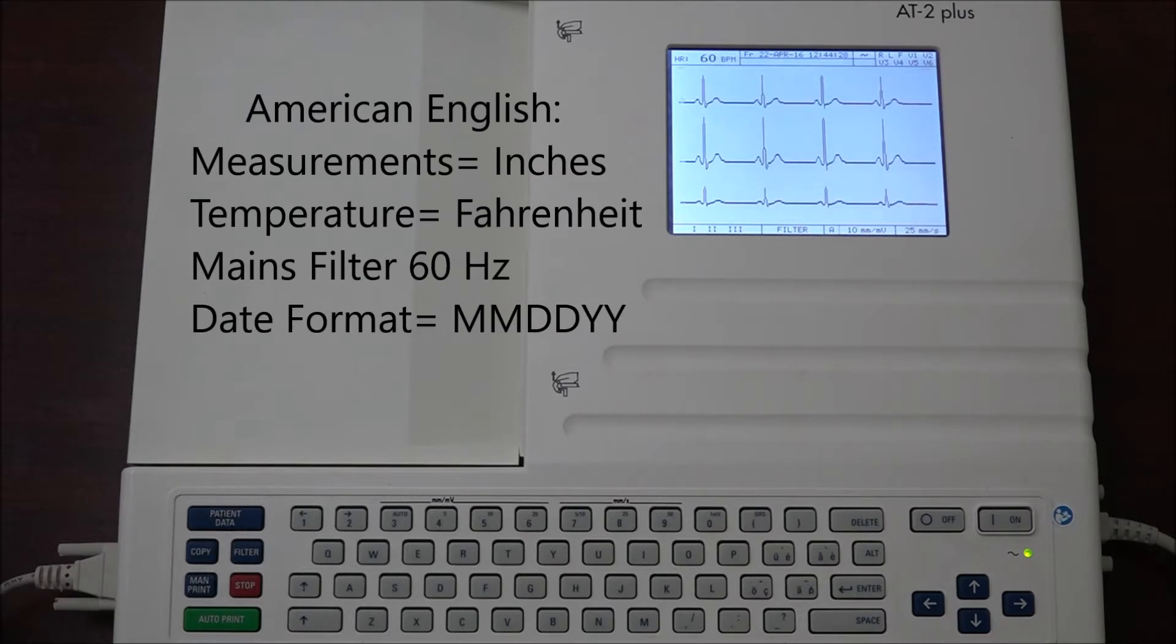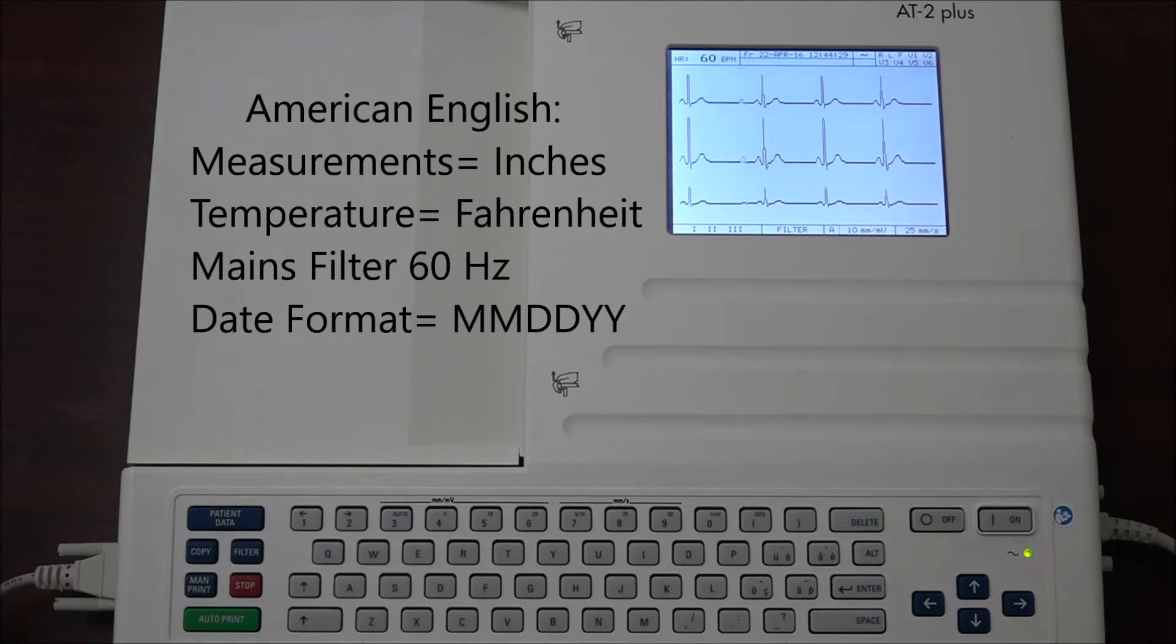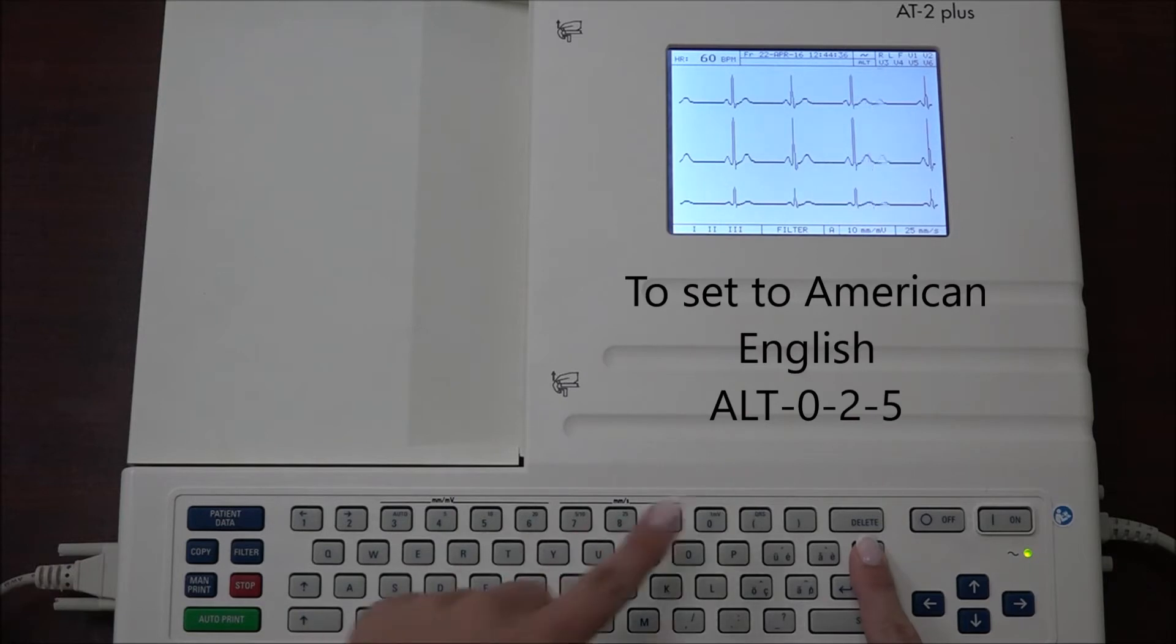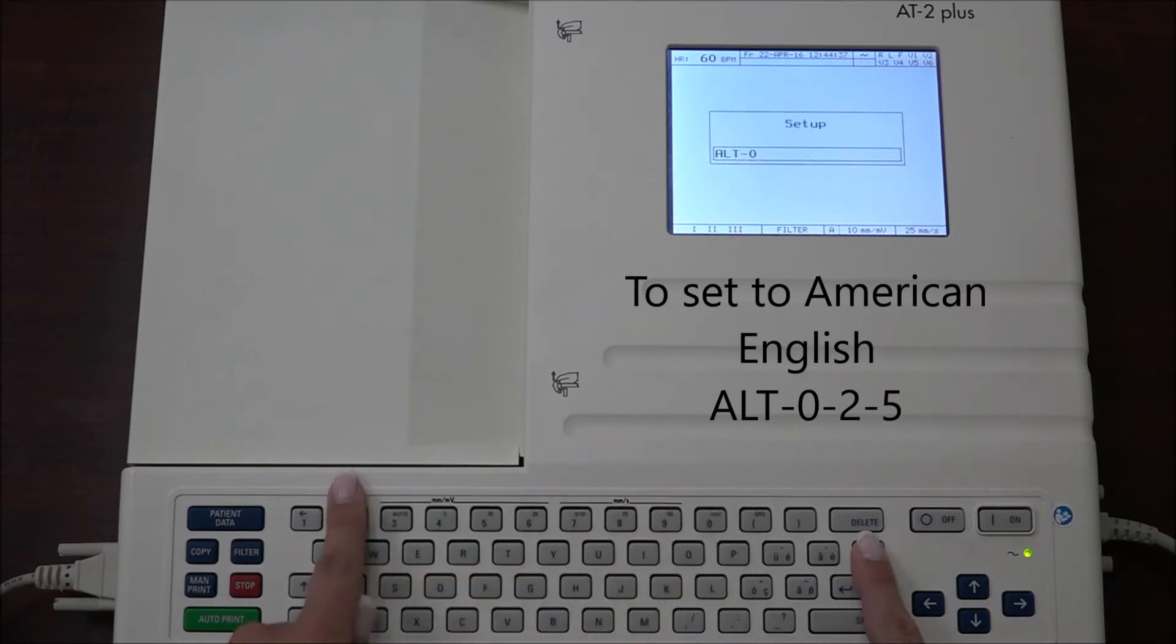In American English, the measurements are in inches, temperature in Fahrenheit, mains filter set to 60 Hertz, and the date format is month, day, and year. To select this, press ALT 0 2 5.